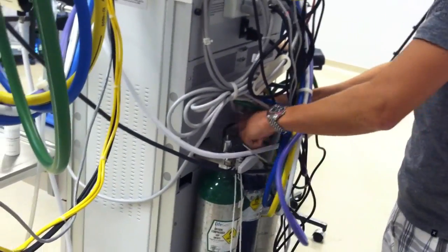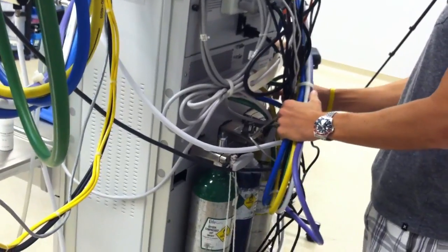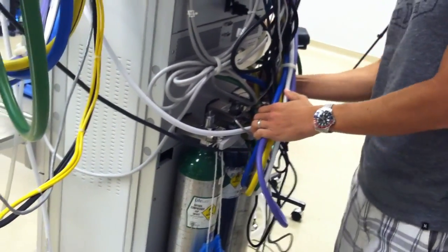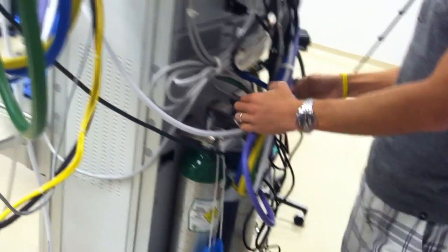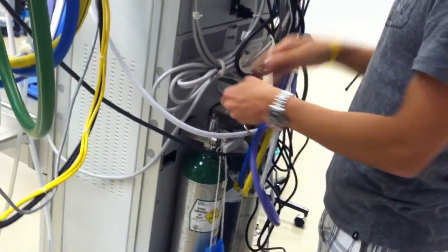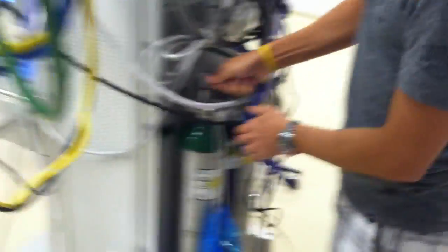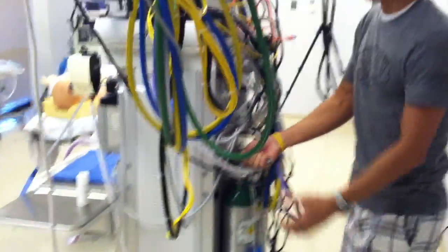All you need to do for the E-cylinders is open up your air — just crack it open for a few seconds, then close it. We'll do the same thing for oxygen: crack it open, then close it. Righty tighty, lefty loosey on those.